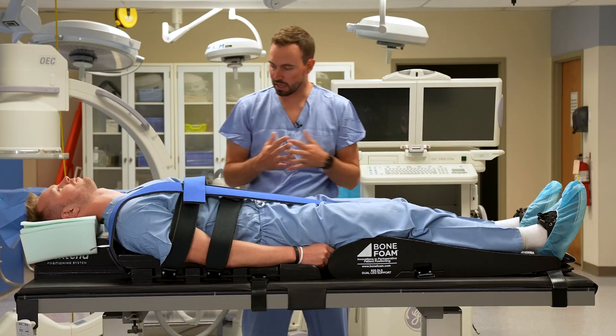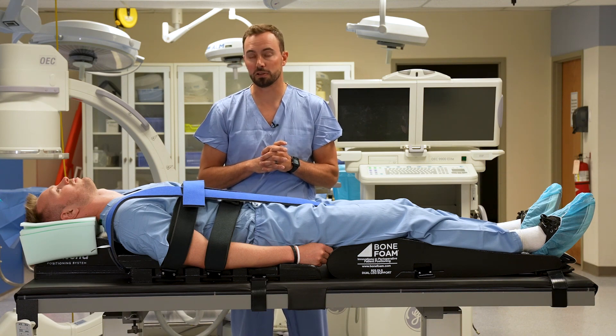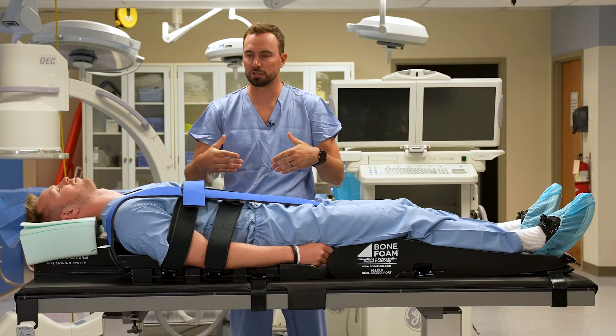That is the setup for the Next End positioning system. We hope this is beneficial not only to the patient and surgeon, but also to the hospital staff, nurses, and everybody who helps with the positioning process before the procedure.